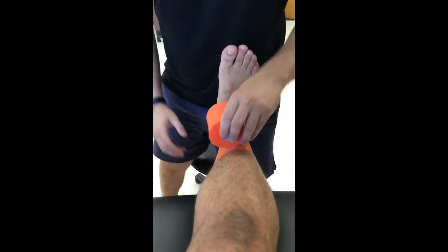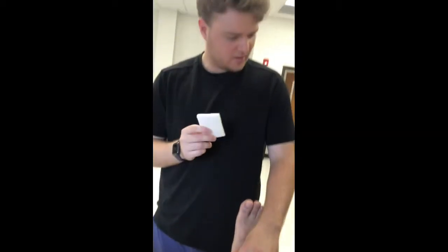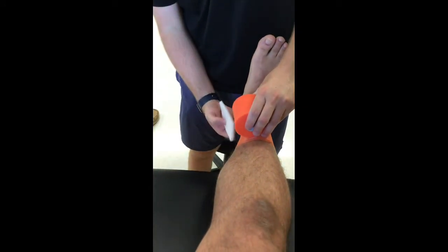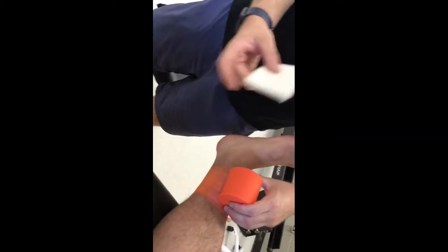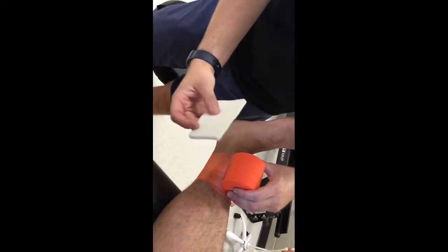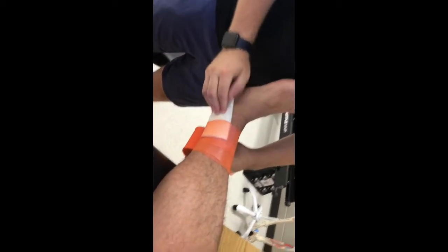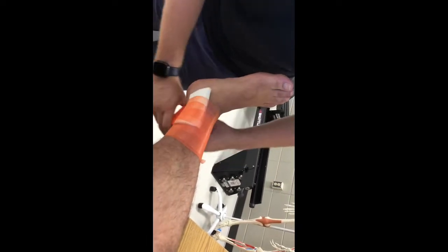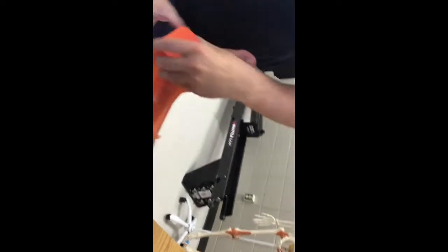And then while we're doing this, we're gonna take one of our pads. Now normally I would use the horseshoe pad for something like this, because I can place it right here and it'll wrap around the bony prominence, but I do not have a horseshoe pad, so I've just got the regular rectangle pad here. And we are gonna go right over it, right on top of that bone, medial side. Make sure we wrap it up good so it doesn't go anywhere.